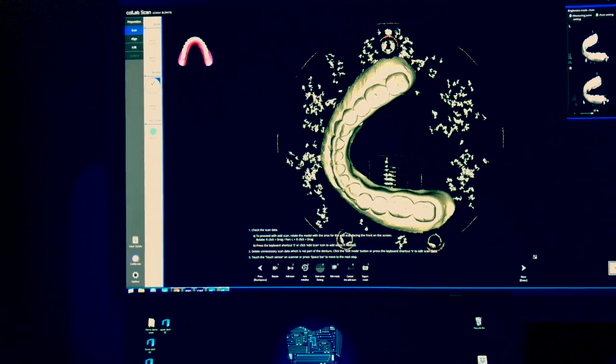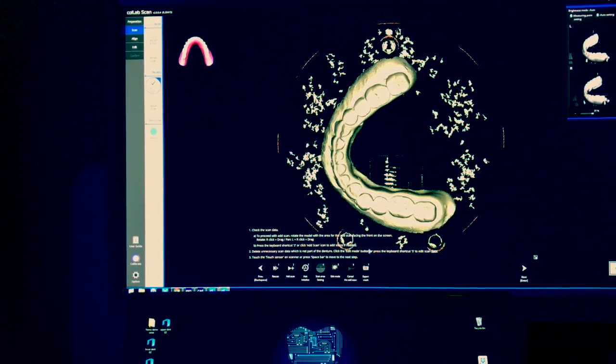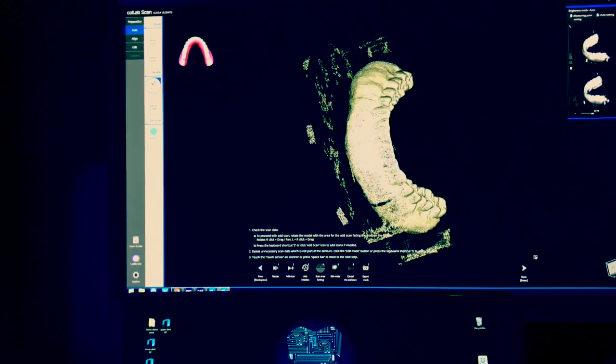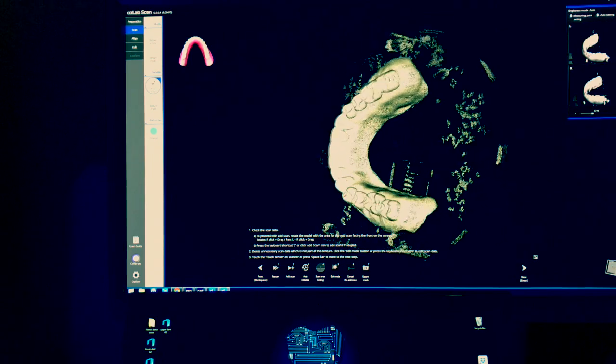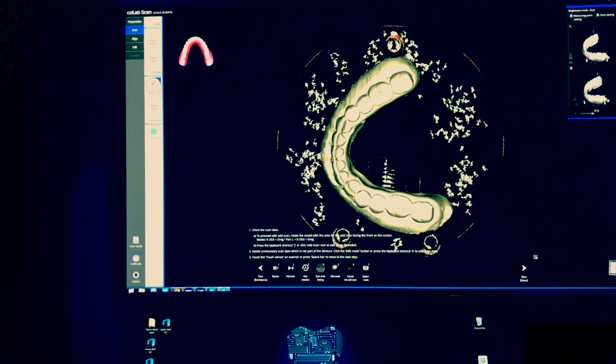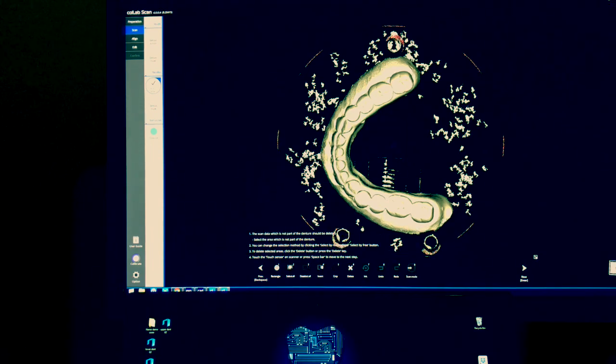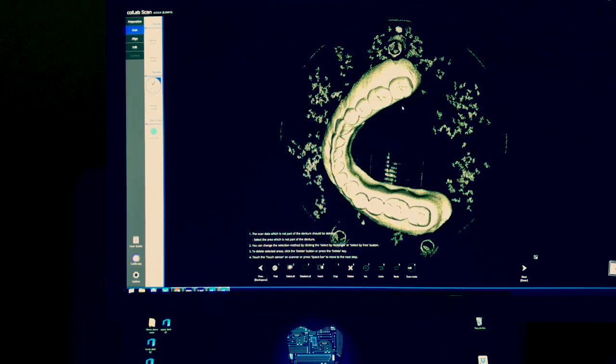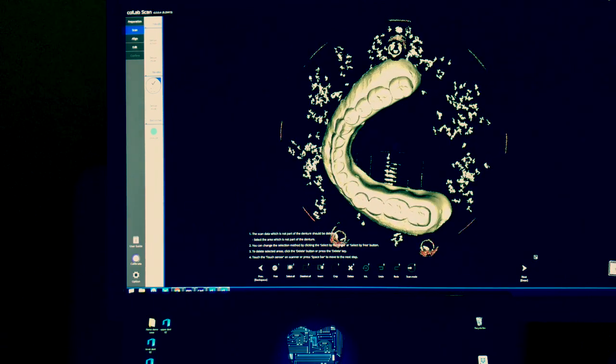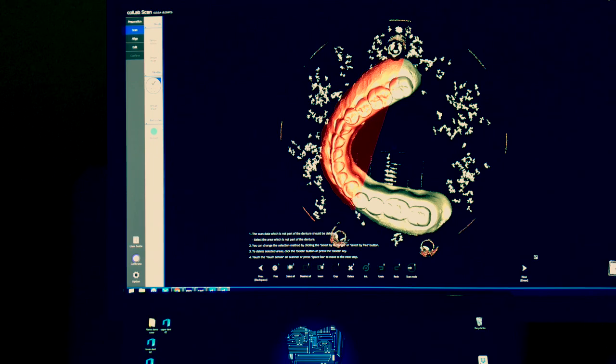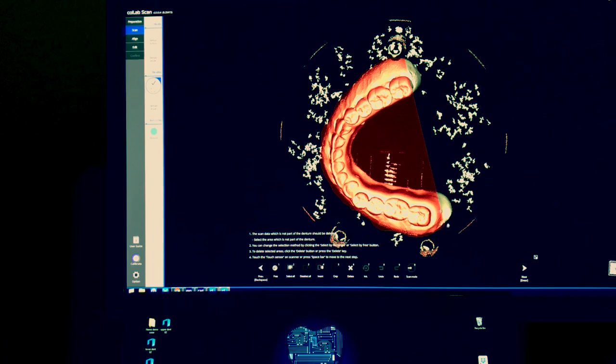The outside part of the denture is done right here. Of course you will have some noise that you want to get rid of. If there is any part you'd like to rescan, you just add a scan. In order to get rid of this noise, go to edit mode where you have a lasso or square tool. What I usually do is very carefully select the denture all the way across. This is the only part of the scanning process that is not automated.